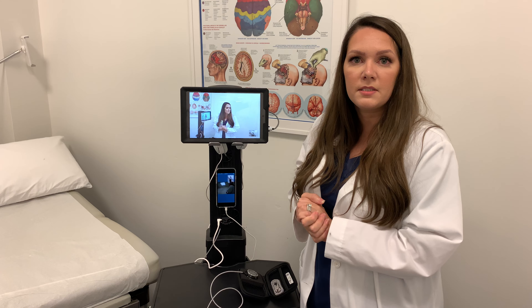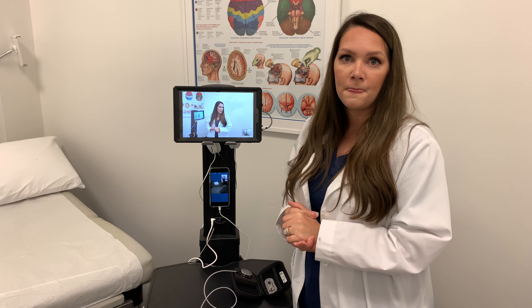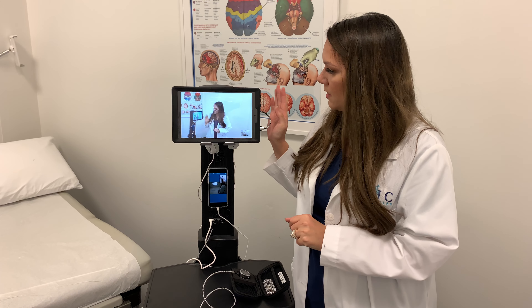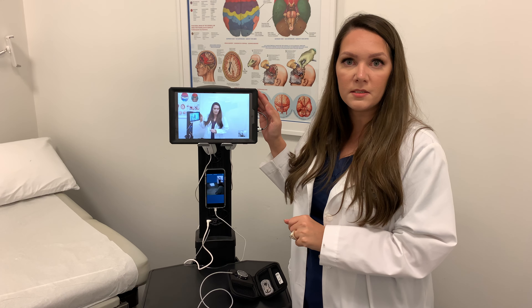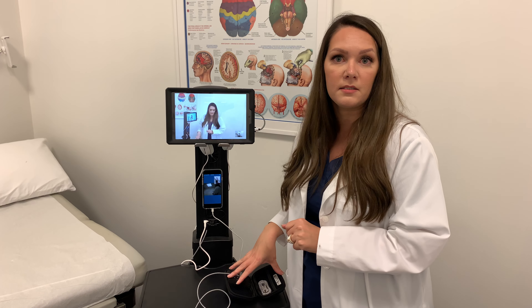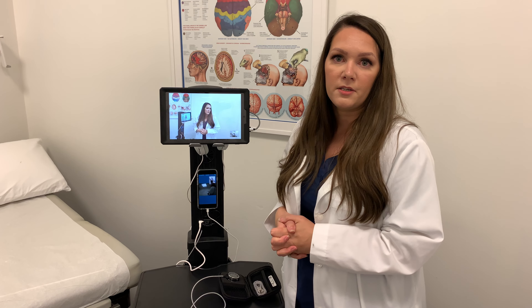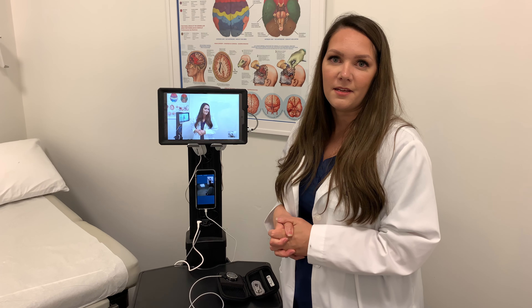The provider can instruct you to listen to the lung sounds, bowel sounds, heart sounds — whatever it may be. There's also a pair of earbuds on here for you, so that you know you're in the right spot and you hear exactly what the provider is hearing.